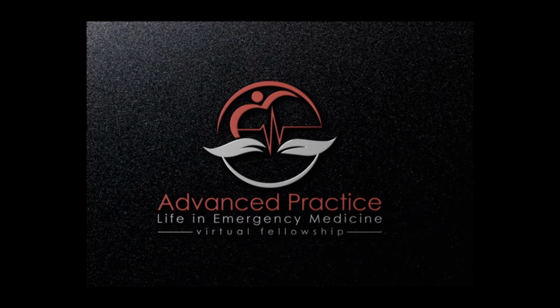I won't get into the basics of ultrasound during this talk, as I have other talks dedicated to the beginning advanced practice emergency medicine sonographer. But this talk is dedicated to the patient that arrives in your shop hypotensive and demonstrating signs of shock. As we all know, shock comes in several different forms and requires immediate recognition and intervention by the emergency provider.